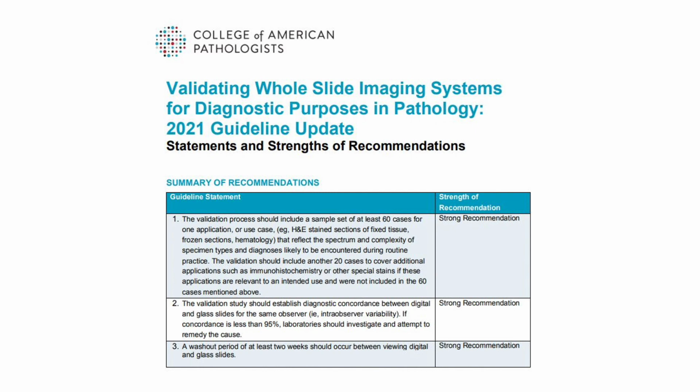Recommendation 2. The validation study should establish diagnostic concordance between digital and glass slides for the same observer. If concordance is less than 95%, laboratories should investigate and attempt to remedy the cause. Recommendation 3. A washout period of at least 2 weeks should occur between viewing digital and glass slides.